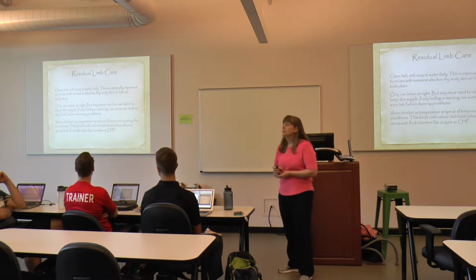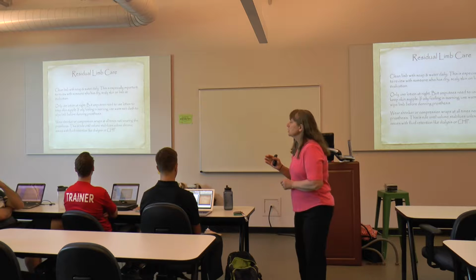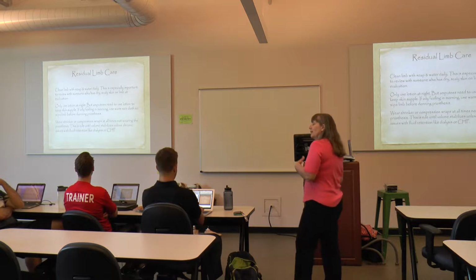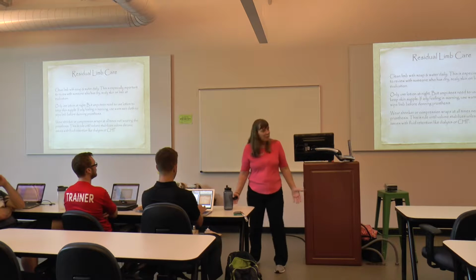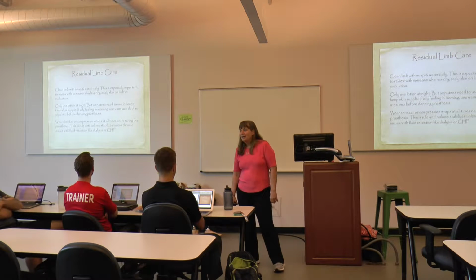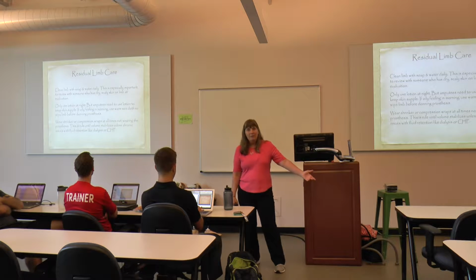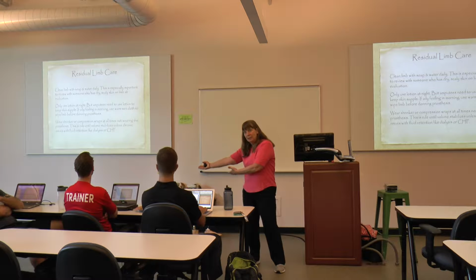Okay, residual limb care. You need to actually clean the leg with soap and water. And yes, touching your leg is good, guys. It's not going to hurt. It's not going to fall apart. You actually wash your leg. If I had dry, flaky skin on my foot, would I wash it and scrub it hard enough to get it off? Yes, do that for your limb.